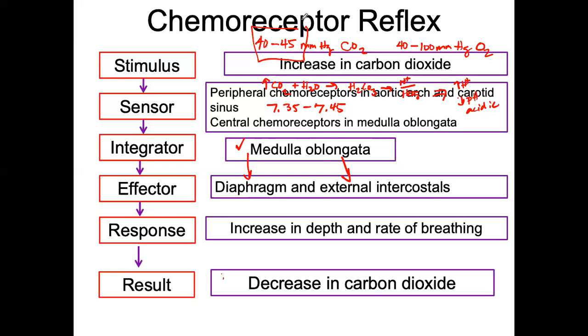Okay, so you're playing with this. So if you're hyperventilating, if you're breathing deep and fast, you're going to blow off more CO2 than you need. So it's going to take you longer to hit this number, right? If you hold your breath, like if you rebreathe CO2, and if you're breathing into a paper bag, then you're going to hit this number faster, right? So you're playing with that.